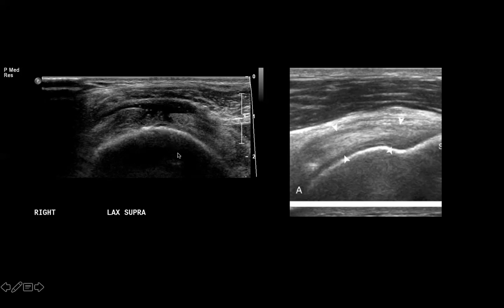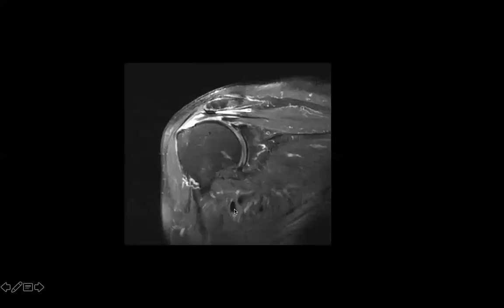This is the MRI correlate of the same exact patient. Here is the supraspinous muscle; this dark hypointense line is the myotendinous junction. The supraspinatus tendon should be dark on all sequences and continue all the way to the greater tuberosity, but instead there's fluid extending from the articular surface all the way to the bursal surface — confirming a full thickness rotator cuff tear on MRI.